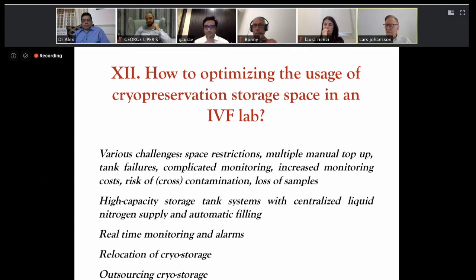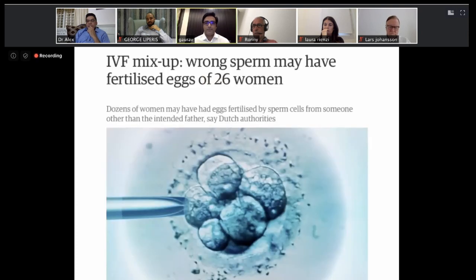But again, there are so many systems on the way, and I think there are more coming out where you can control, not only with what you have from Research Instrument or Matcher. More are coming out, and we'll see in the near future. So I'm sure we will now have to resort to these changes in our daily practice, where perhaps the whole idea of outsourcing cryo storage or relocation of that cryo storage, which doesn't occur to us, might be a very, very useful solution for the whole problem.